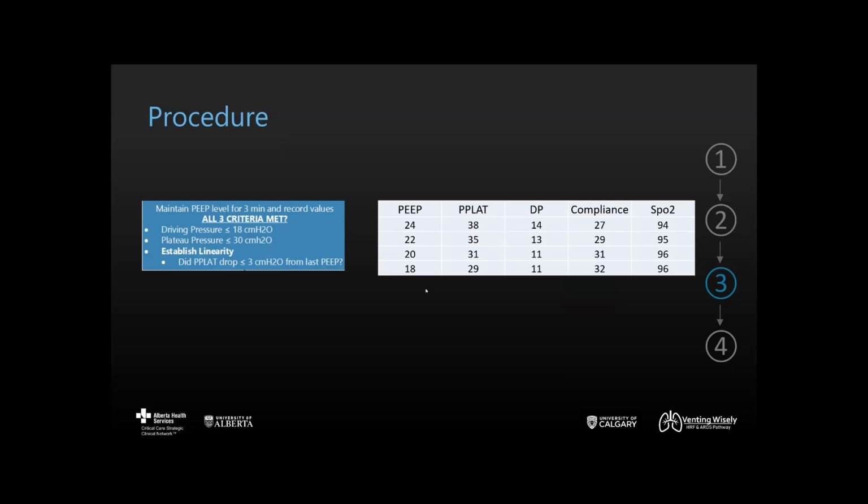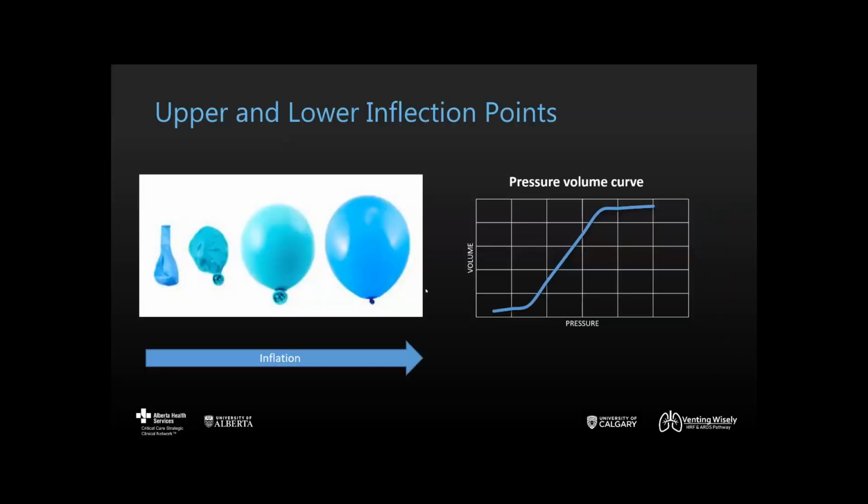Actually, yes. Our driving pressure, yes. Plateau pressure, yes. And what about linearity? Well, seeing a drop in plateau pressure of 2, then yes, we have established linearity from a PEEP of 20. And this is a good time to expand on that idea of linearity.